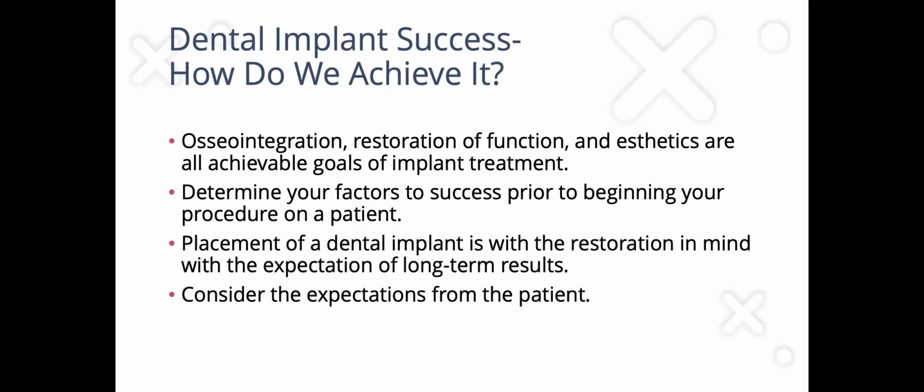And so some of you may be asking, okay, well, how do we determine whether we placed an implant and it was successful? And again, that can be subjective to some point. But again, one of the elements you can look at is obviously osseointegration has to be a part of that. Restoration of function and aesthetics are all achievable goals when we're talking about implant treatment.